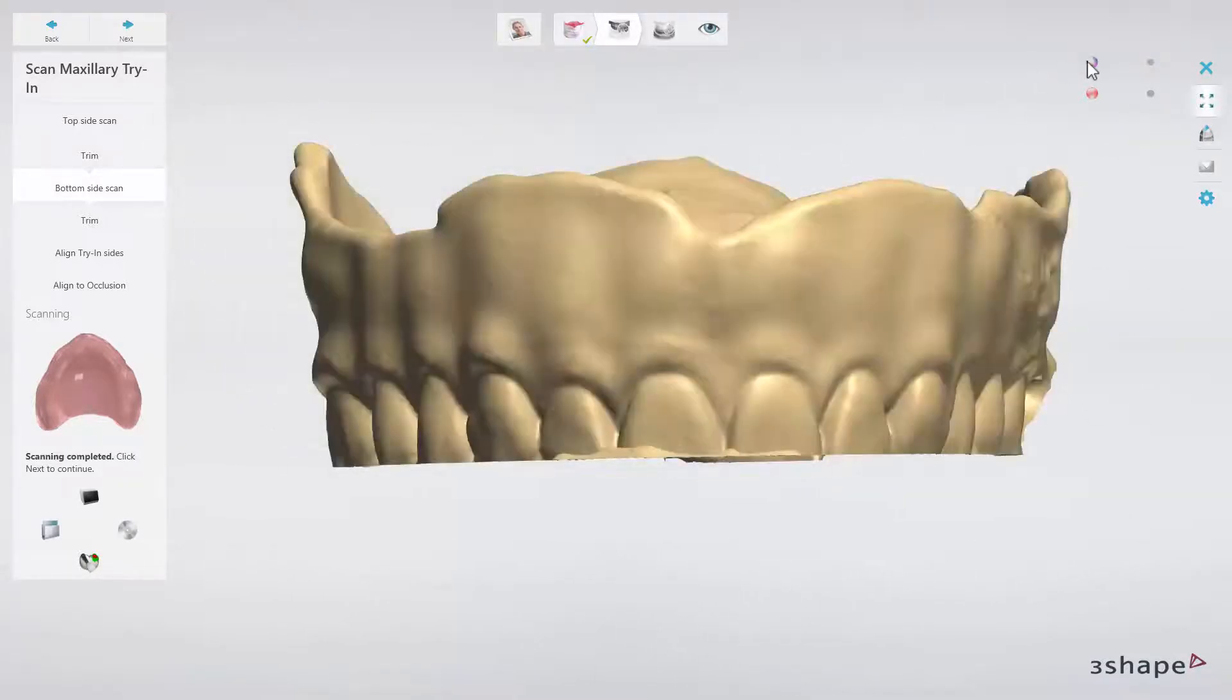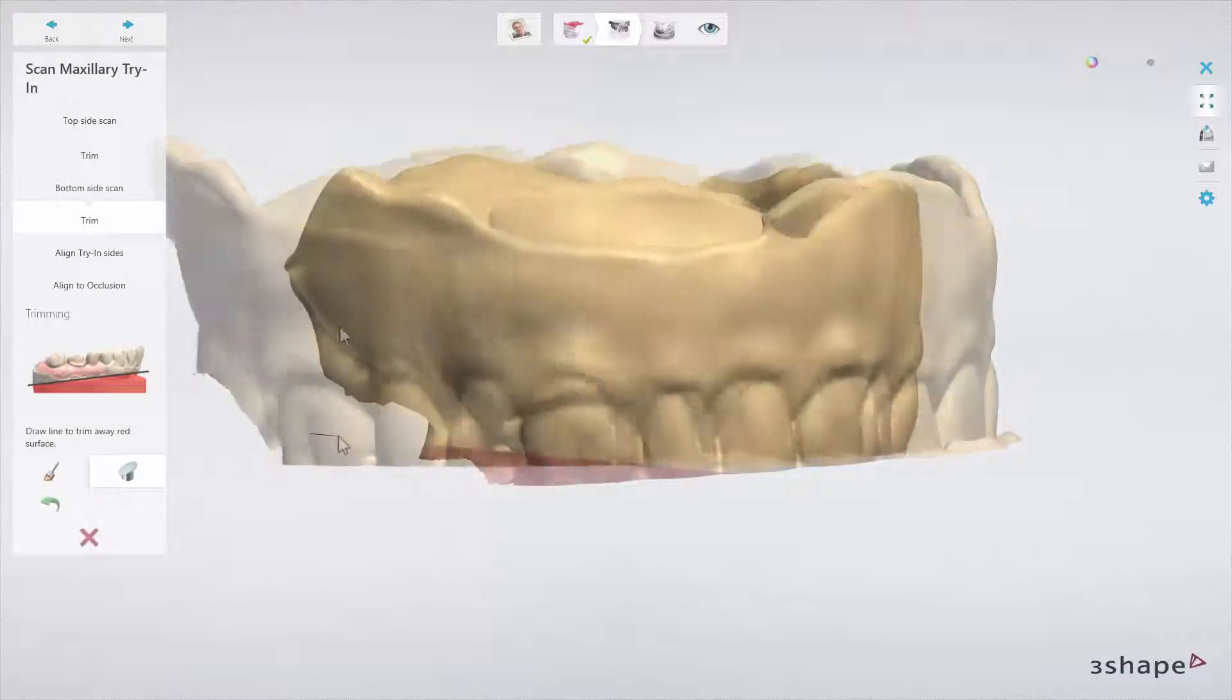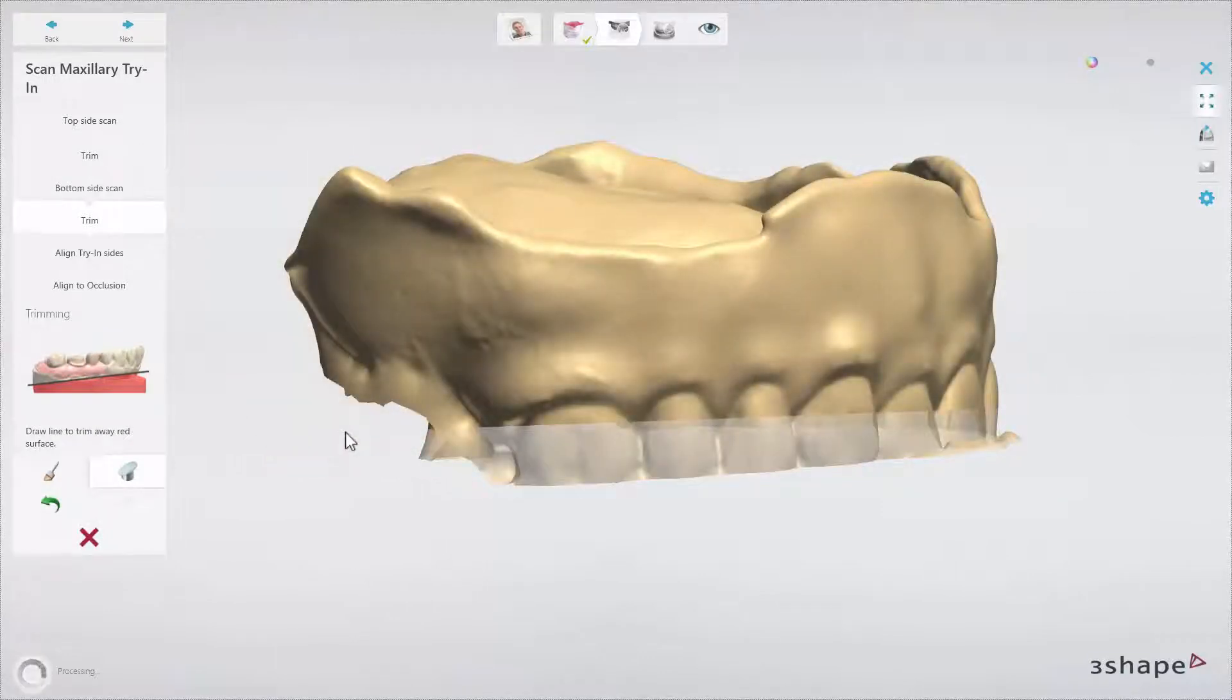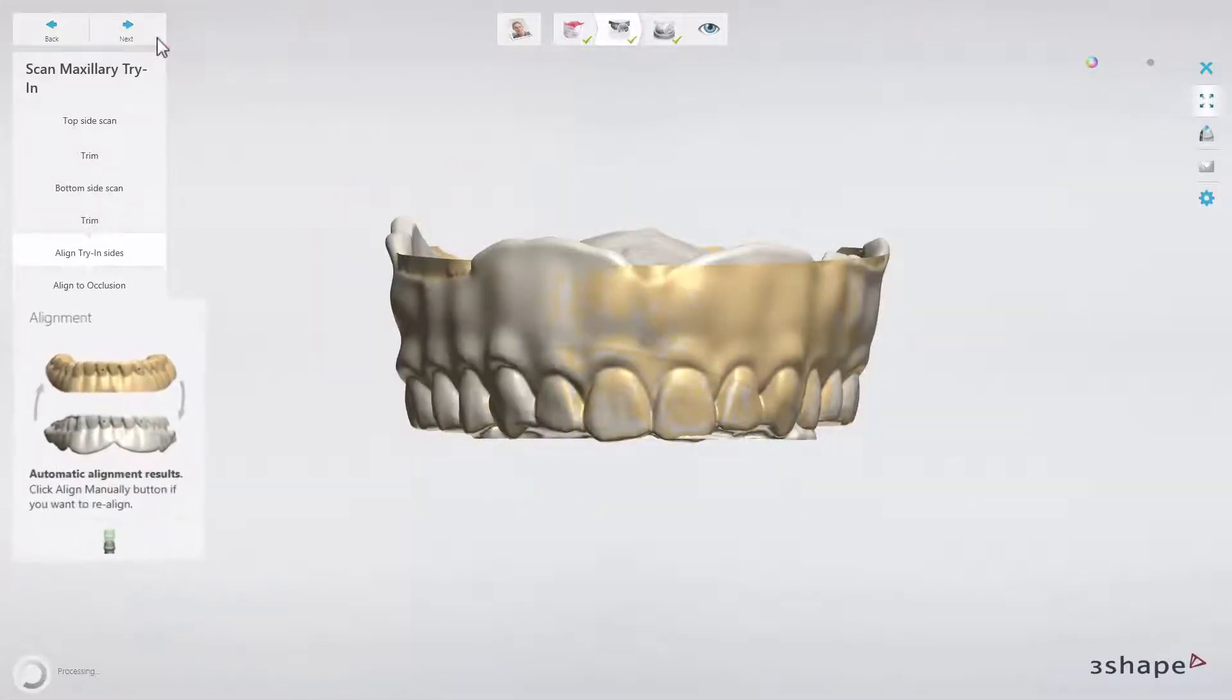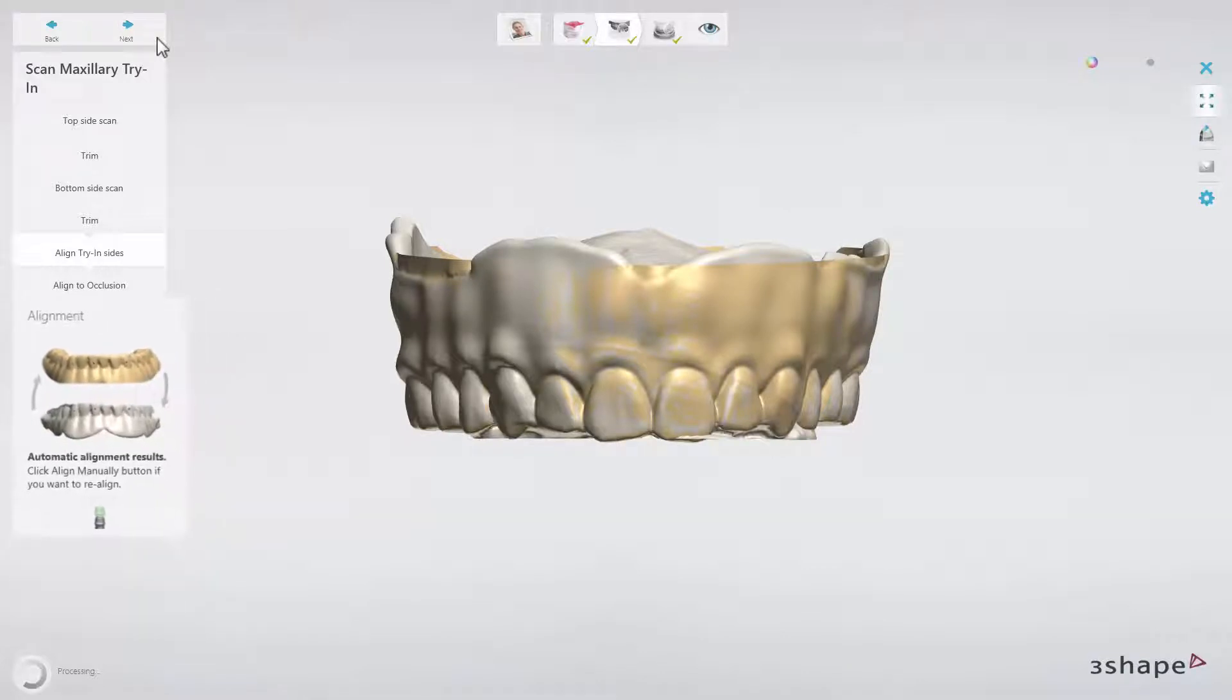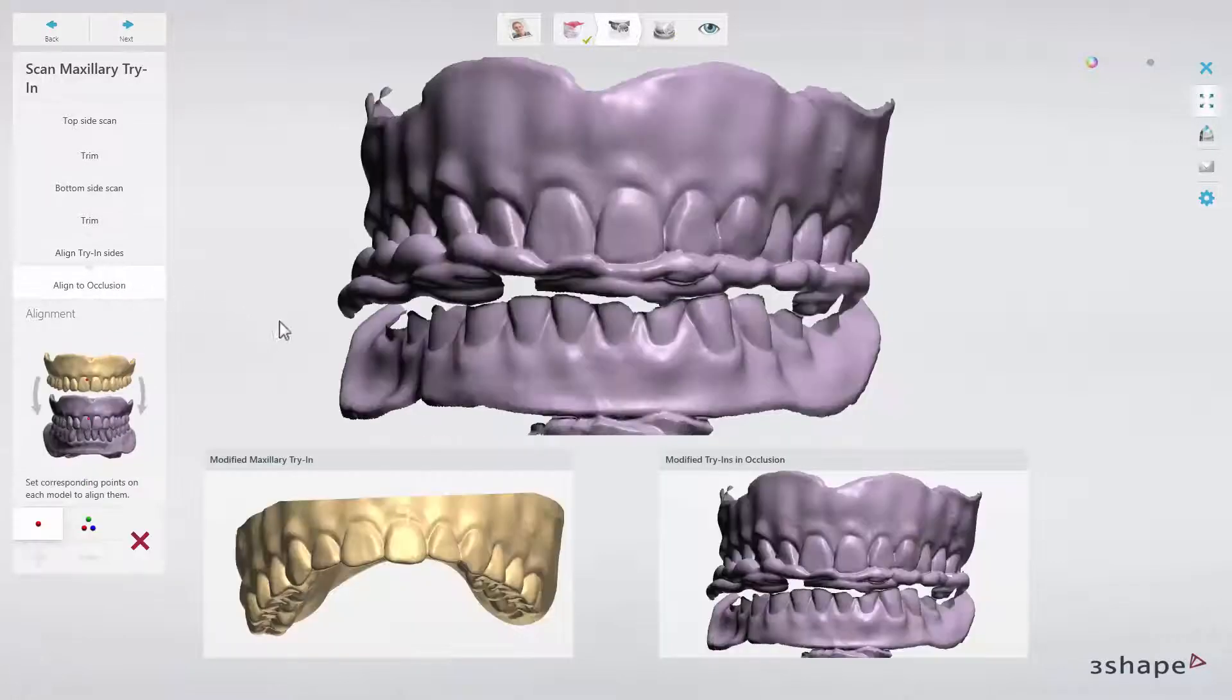When scanned, trim away the part with BluTac one more time. After scanning both sides, the software will align it together. You can adjust the alignment using one or three-point alignment if necessary. Having a scan of the upper try-in ready, align it with the new occlusion scan using one or three-point alignment.